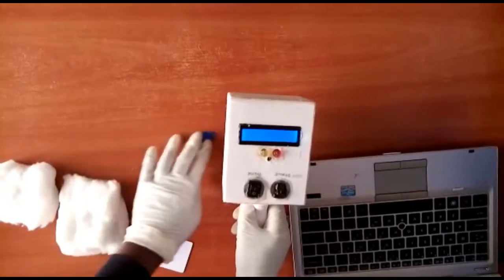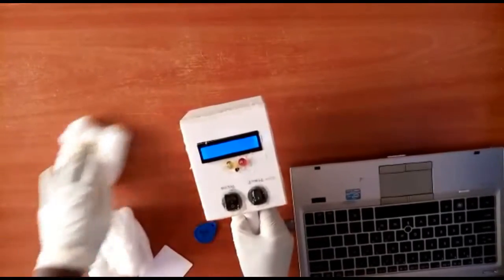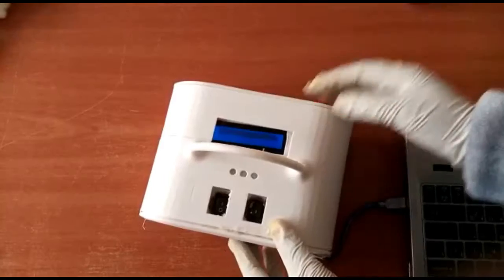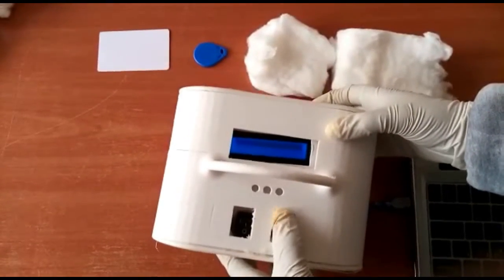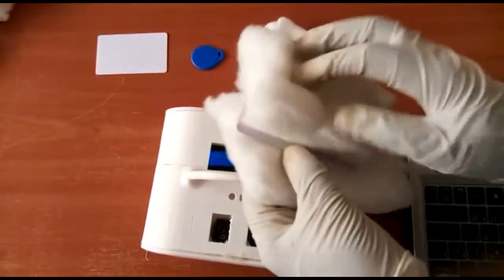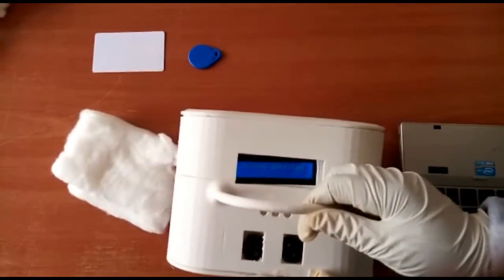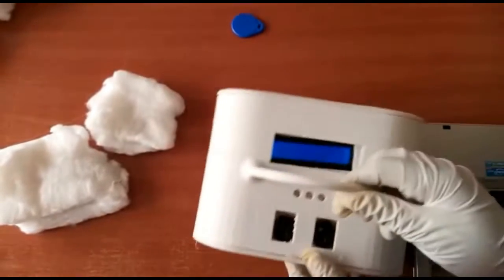To demonstrate how the hybrid scanner works, we do some tests before we place the main device inside the outer casing. So the LED glows yellow, the buzzer beeps, and the LCD prints detected. Sponge detection mode. I'll scan these 4 sponges using the hybrid scanner. I turn on the sponge detection mode by pressing the button, and I'll start with the white RFID card which I've placed inside the sponge. By moving the scanner around it, the LCD writes sponge detected. The LED also glows yellow, and even with the blue RFID tag, it writes sponge detected.